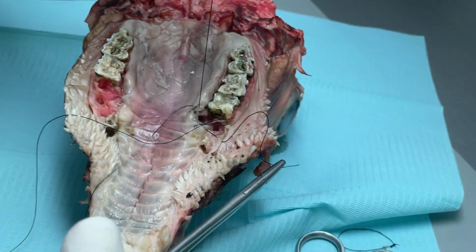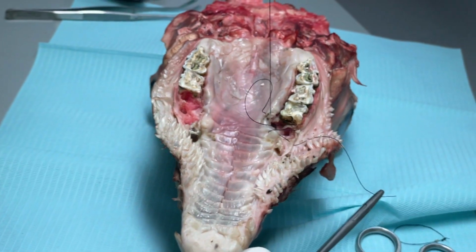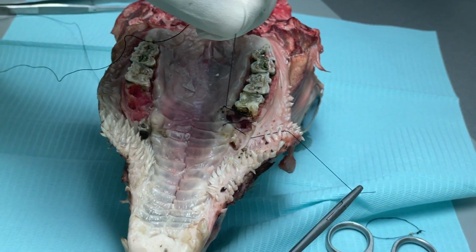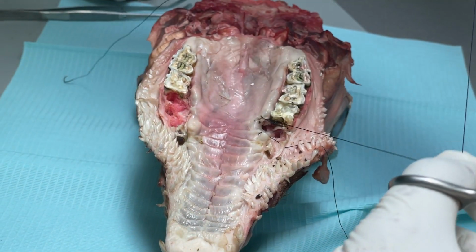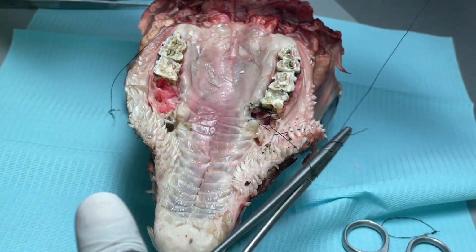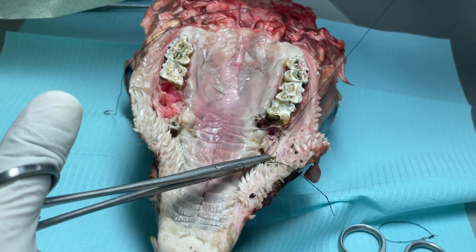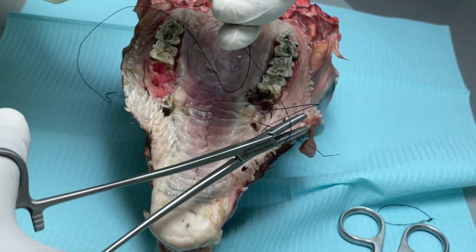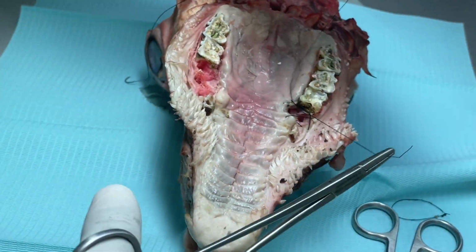Hold this end. Clear this end. Okay, and come across. Now go to number 1. Go to 1. Then 2 clockwise, without incising. 2 clockwise. Lock it. 1 anti-clockwise. Is it granny? No, surgeon. Lock it. See, it has to come on the buccal side.